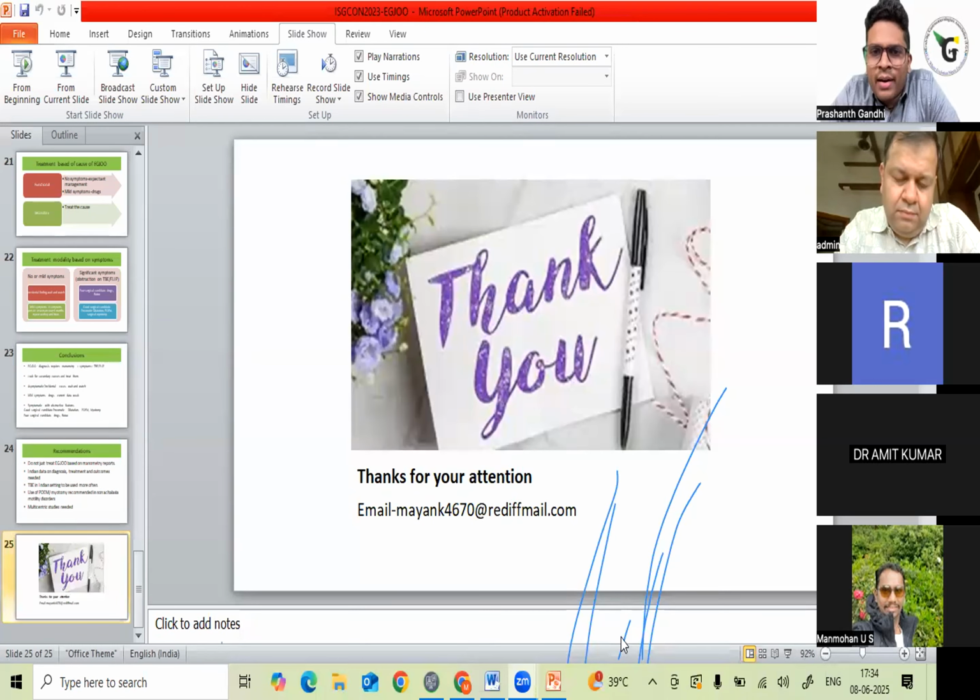So is it an EGJ outflow obstruction with spastic features as per the software, or should we label it as achalasia type 3? He has posted a picture in the group chat, and also the barium swallow. Of course, we don't have the timing of it.